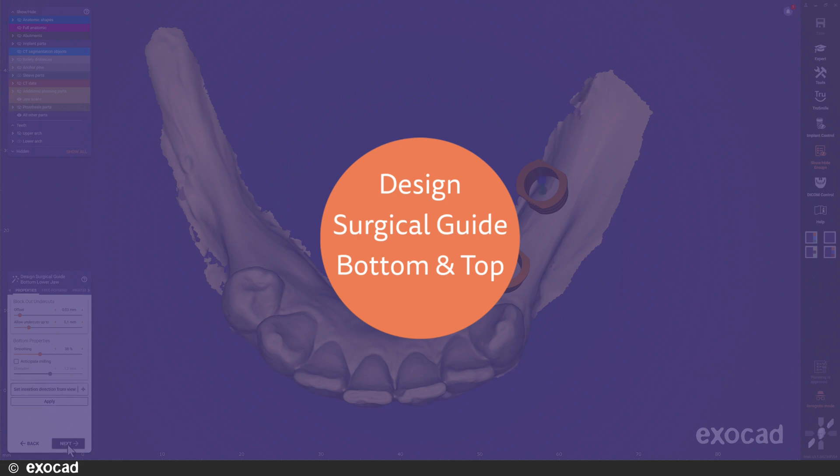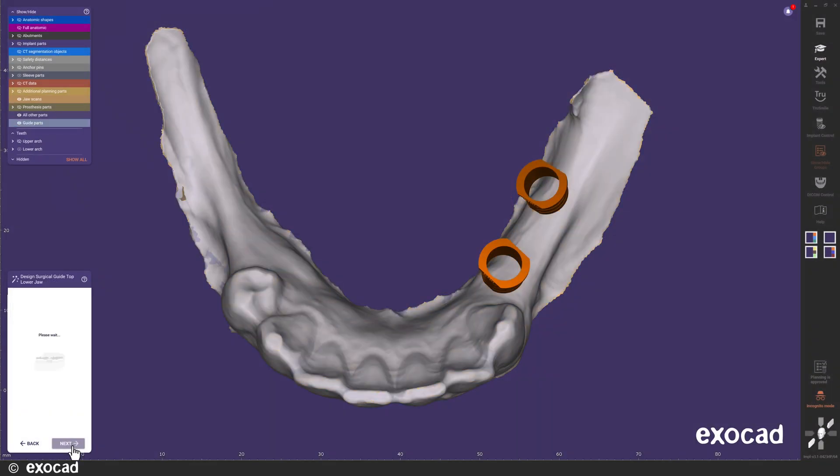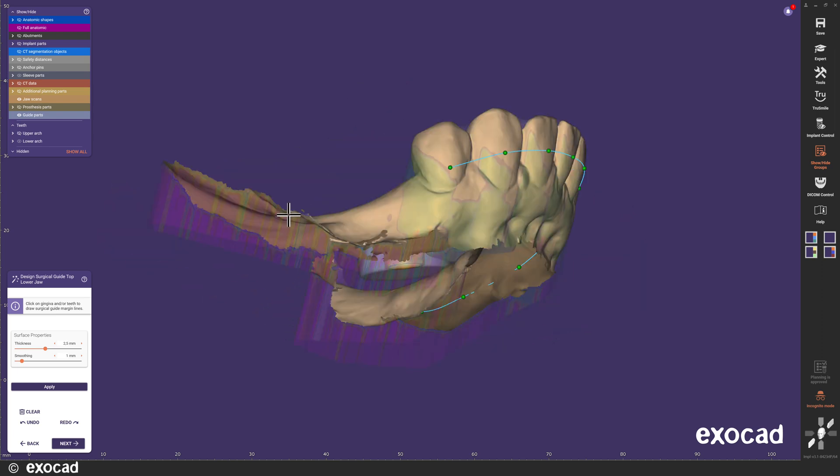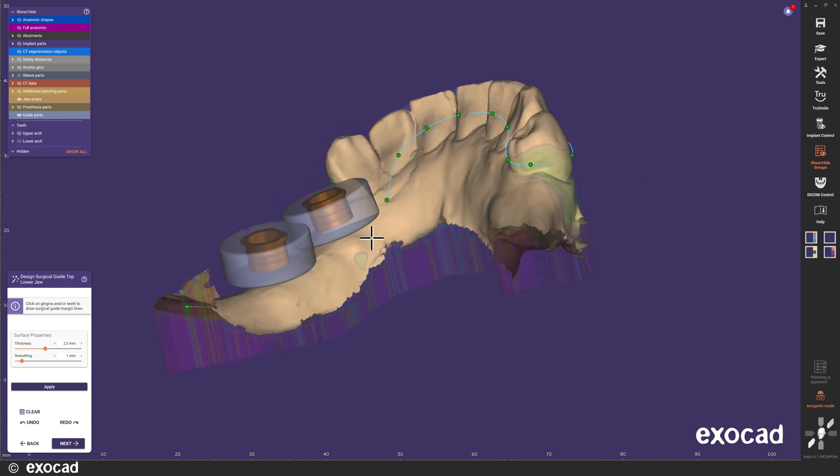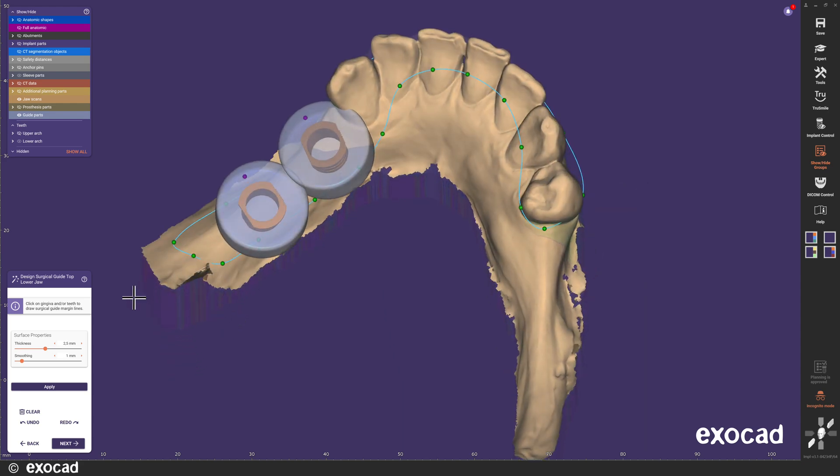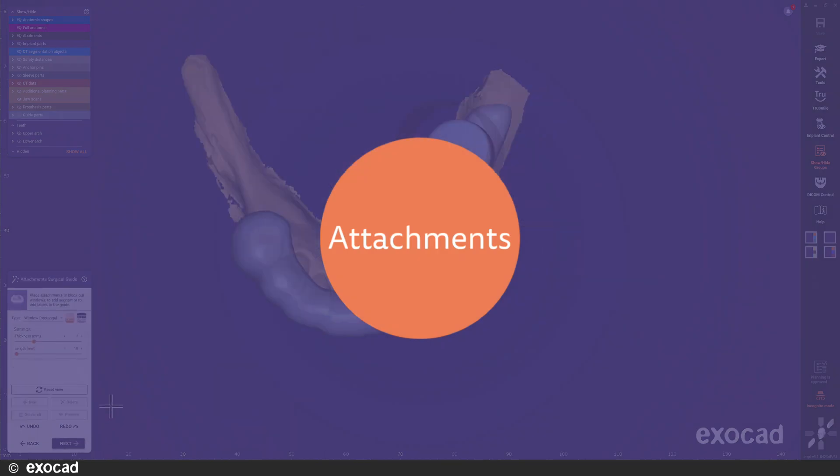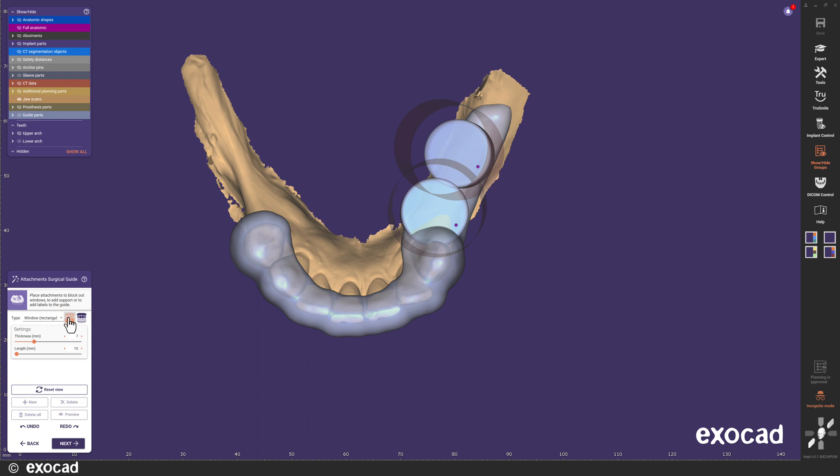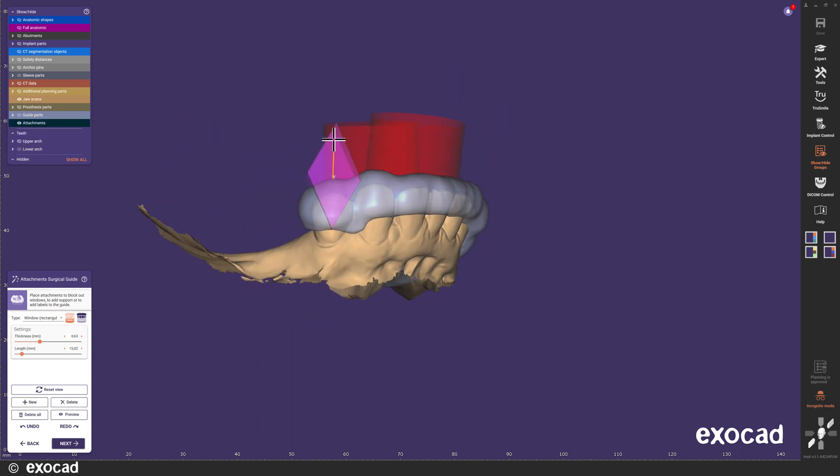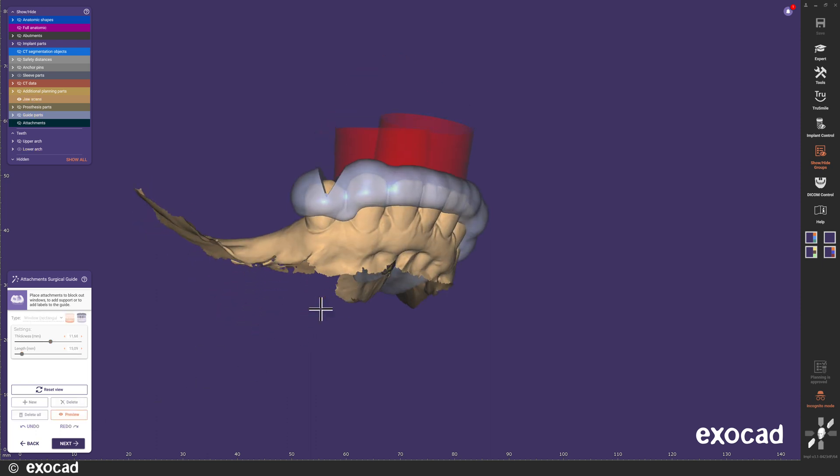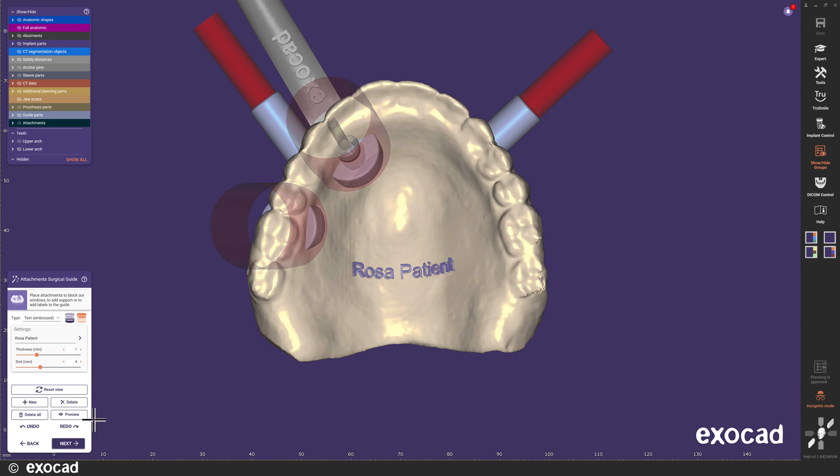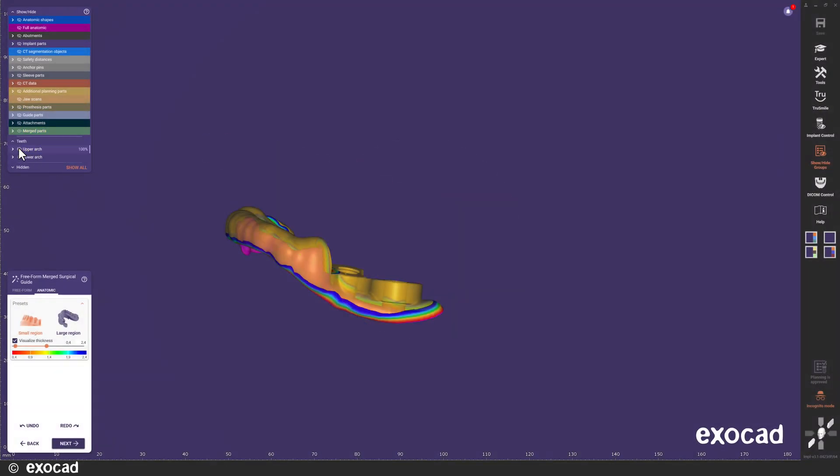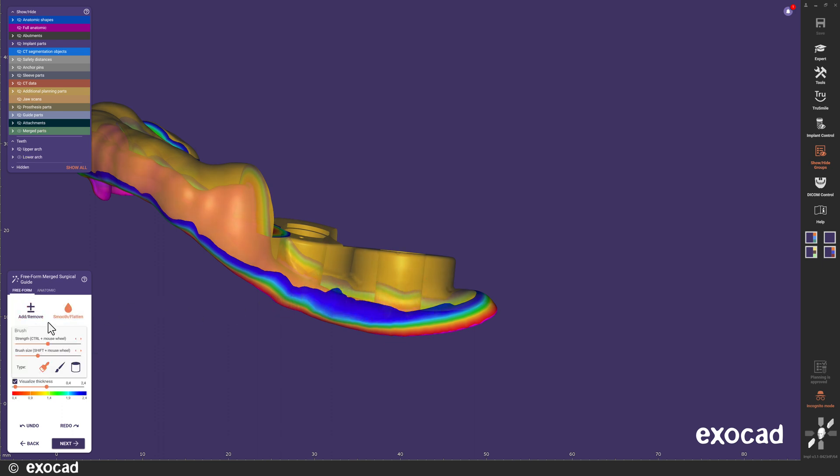Time to design the guide bottom for the lower jaw guide. And now, the top part for the lower jaw guide. In the attachment step, we have added toggle buttons for upper and lower jaw. I'm going to place a few attachments, and then continue to the merge step.